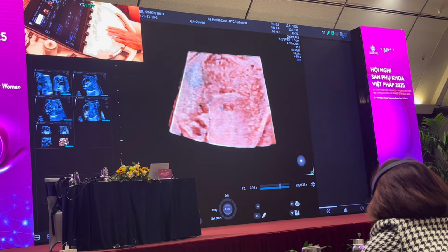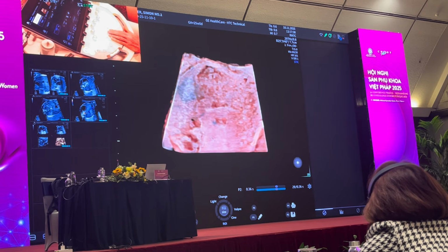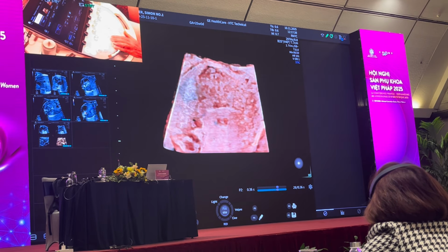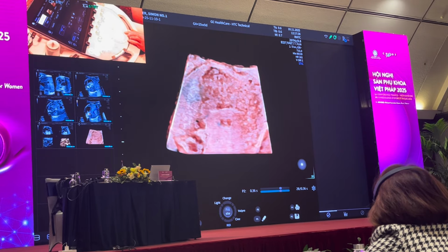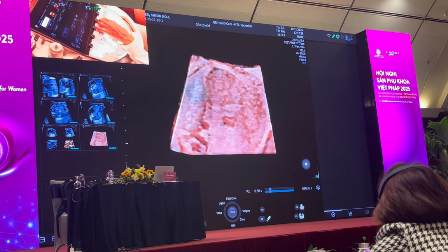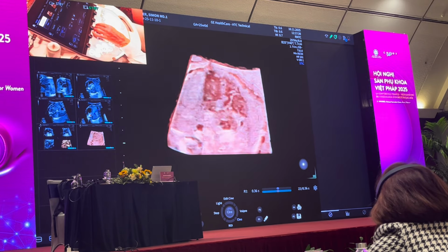I'm just going to select my region of interest, position my volume, and then start again. Remember, when you're evaluating a volume, ensure that you save your volume, otherwise you will lose it. And now I translate to my volume, and I can see my complete AV canal defect.